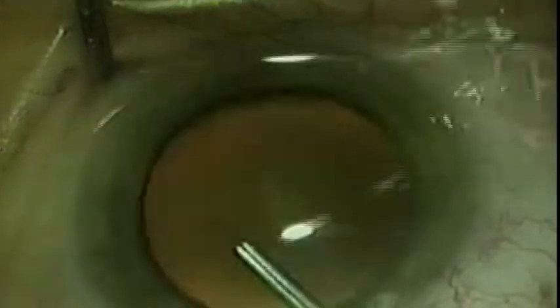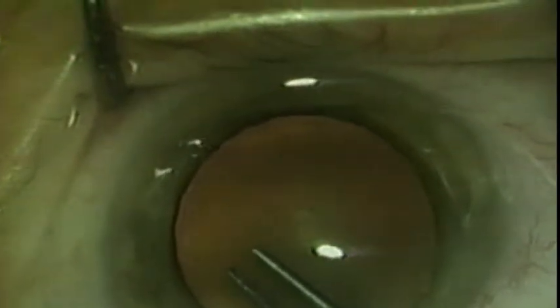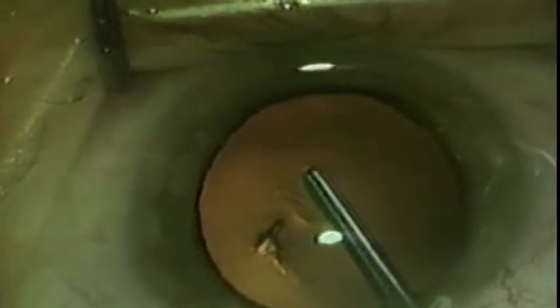The technique of capsular rexis is demonstrated. The instrument handles are grasped with the thumb and index finger, and the blades are brought together. The instrument is passed through the keratotomy incision. A bolus of viscoelastic is injected, and the anterior capsule is grasped at 2 o'clock, approximately 2 millimeters from the center of the lens.